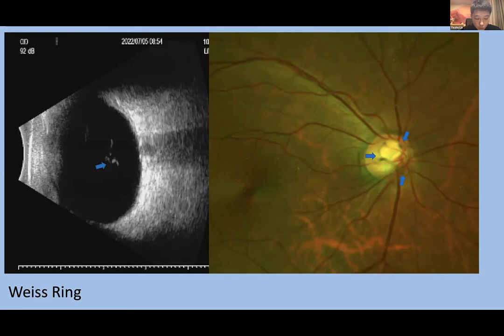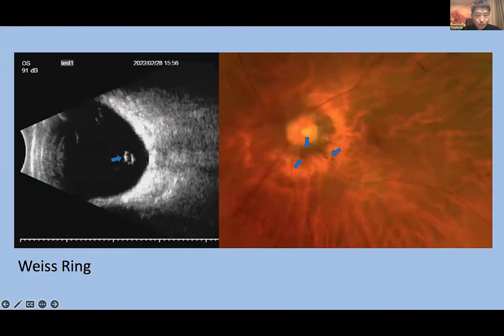The investigators also looked for the floaters on Optos images, and for inconsistencies, the senior investigator made the final decision. This is a classic pair of photos. We can see the Weiss ring here, and also the opacity above the optic nerve. This is another pair of floaters.